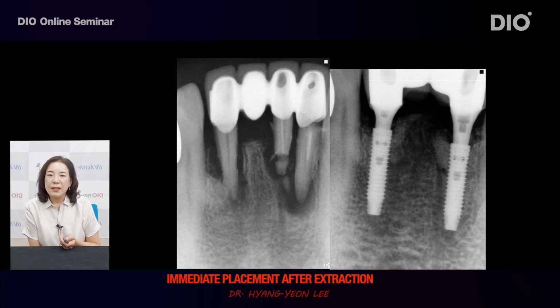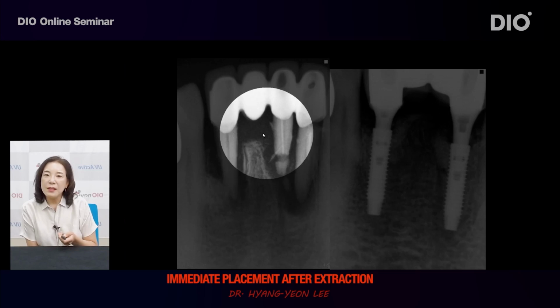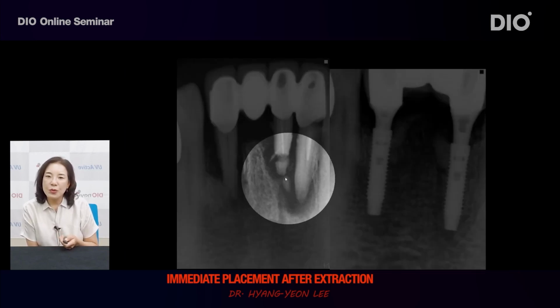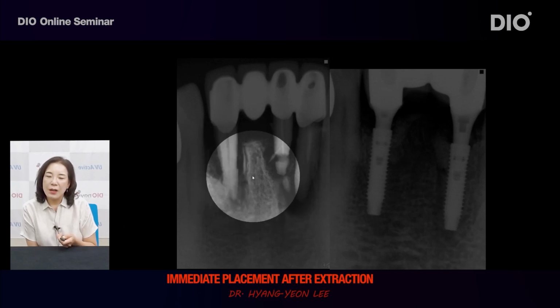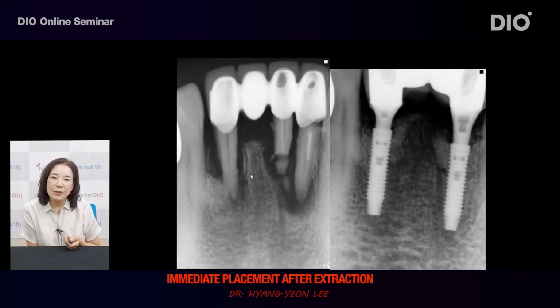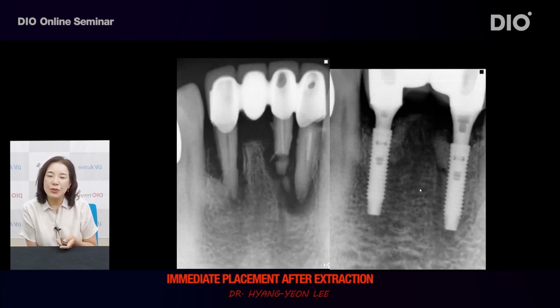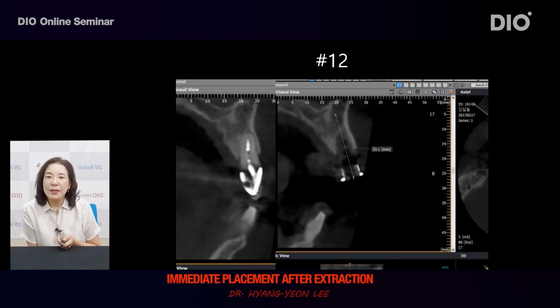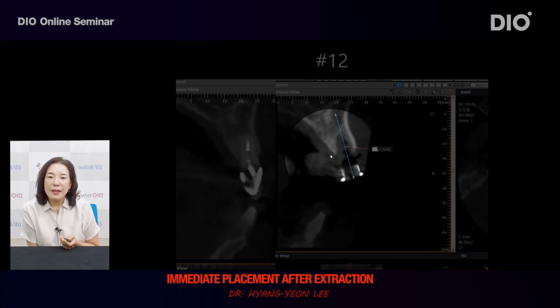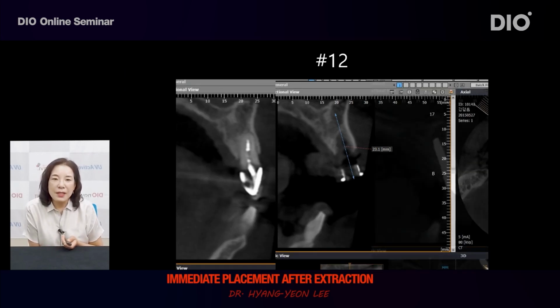As it can be seen in this patient also, if this tooth is extracted, substantial portion of the remaining bone tissues would have been absorbed along with the tissues of inflammation. It can be seen that performing GBR after the tooth extraction prevents excessive absorption of these bone tissues. In particular, in the case of anterior tooth, bundle bone will be left behind if tooth is extracted. This bundle bone has a tendency of being absorbed easily since blood is not being supplied harmoniously.